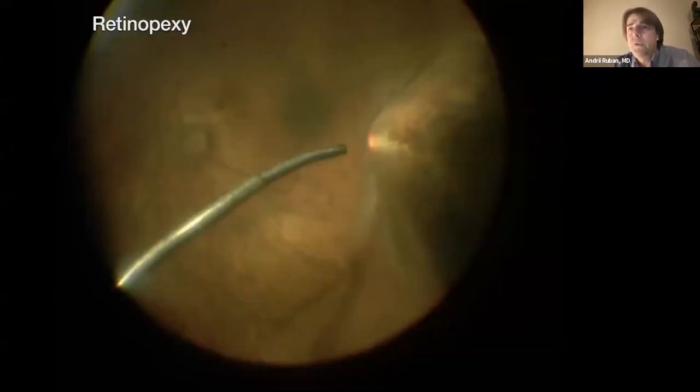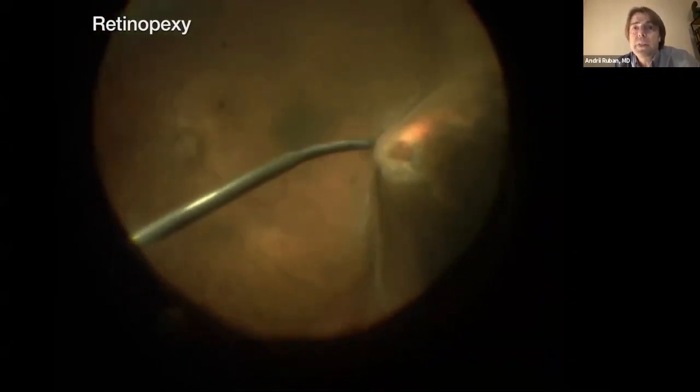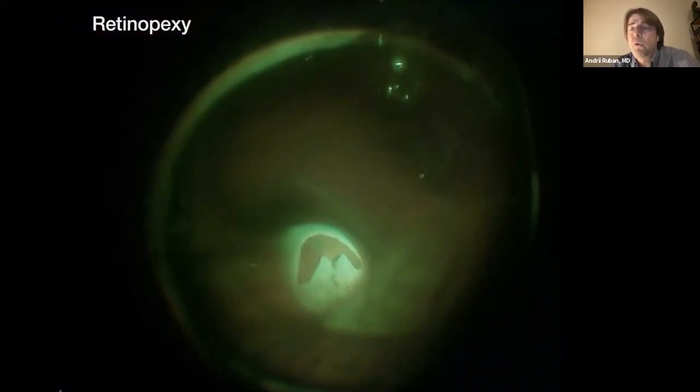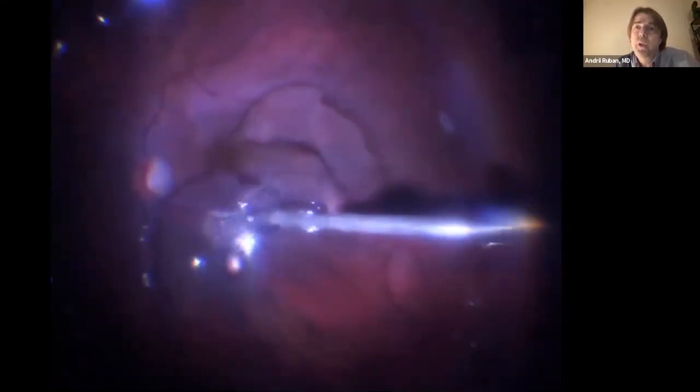I don't regularly perform 360-degree laser treatment because I'm not sure that this approach reduces the risk of postoperative retinal detachment. But in those cases when I do it, I don't touch the horizontal meridians. And of course, I very much like cryo. I would like to emphasize the importance of removing the PFCL bubble as completely as possible at the end of the operation, and BSS rinse after PFCL exchange may help to collect the microscopic PFCL drops.